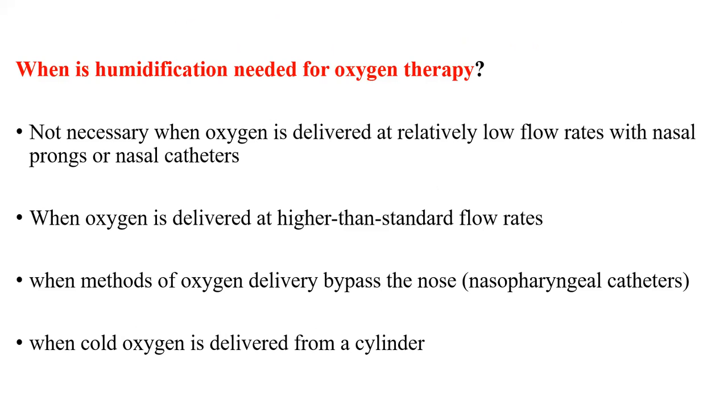But when you are using high flow, it is better to humidify that oxygen, because the oxygen is dry. If not humidified, it will dry the airway, meaning that humidification is necessary to prevent that dryness. Next slide.